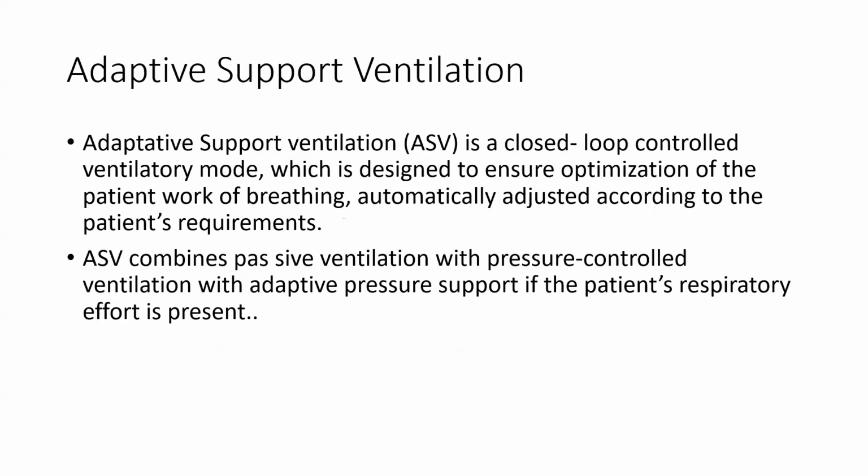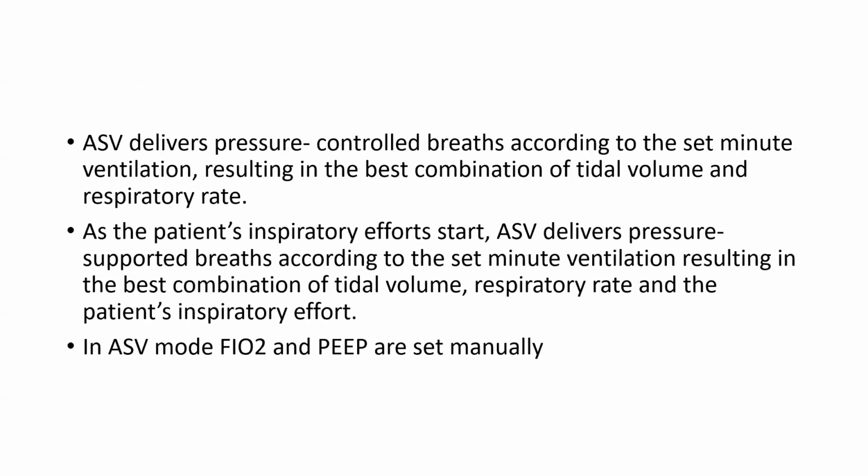Now the next is adaptive support ventilation. Adaptive support ventilation is a closed-loop control ventilatory mode, which is designed to ensure optimization of the patient's work of breathing, automatically adjusted according to the patient's requirement. ASV combines passive ventilation with pressure control ventilation, with adaptive pressure support if the patient's respiratory effort is present.